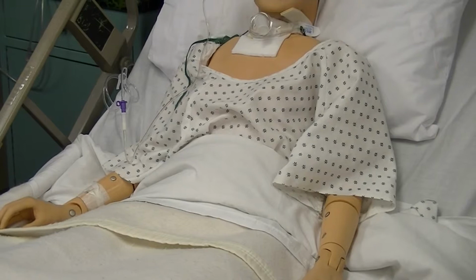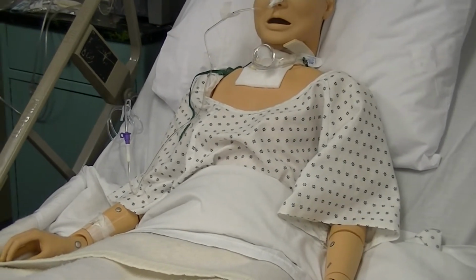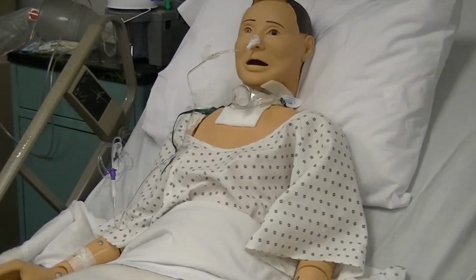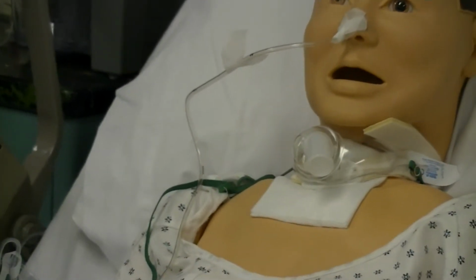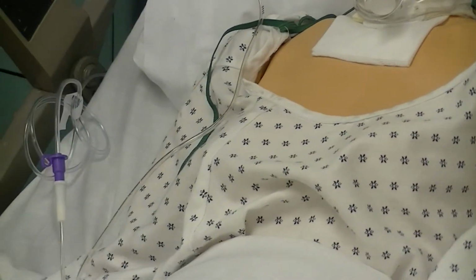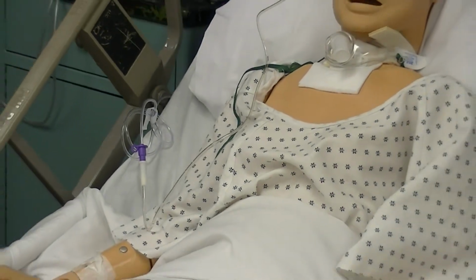Okay, that concludes our demonstration for nasogastric tube insertion. A few nursing considerations are going to be, you want to make sure that you are marking the length of your tube prior to insertion. That way you're not going too far or not far enough. You always want to check placement of the tube. A quick check you can do is checking the gastric contents for pH.